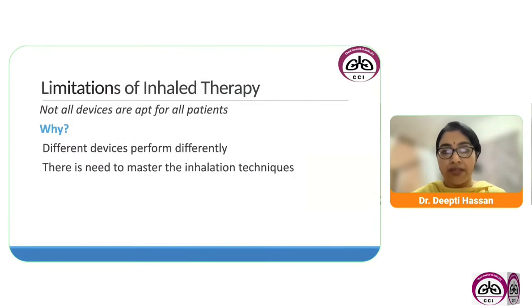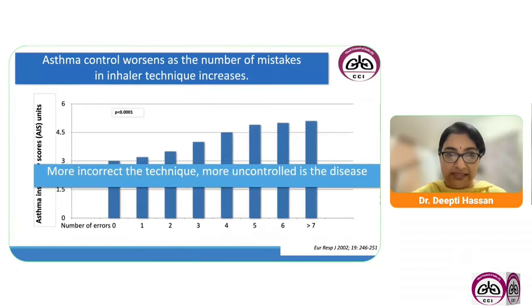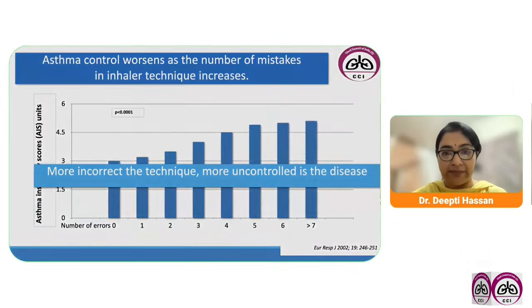So not all devices are apt for all patients. Why? Because each device performs differently, and there is a need to master these techniques. And that is also important because we have noticed with a study that as the number of mistakes in an inhalation technique increases, the asthma control worsens. So the more incorrect the technique, the more uncontrolled is the disease.